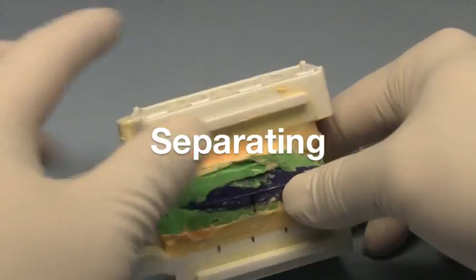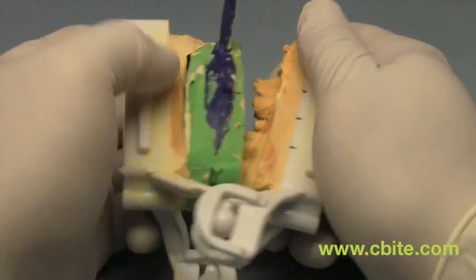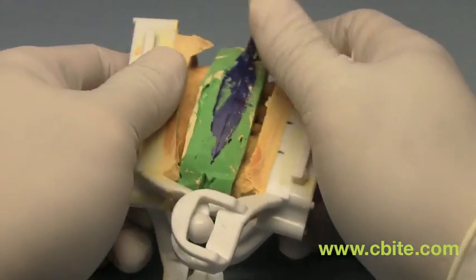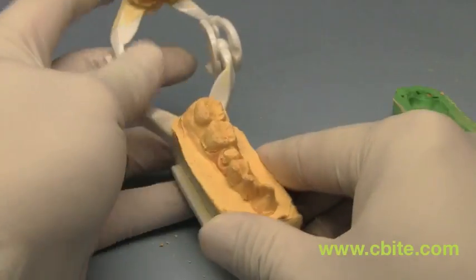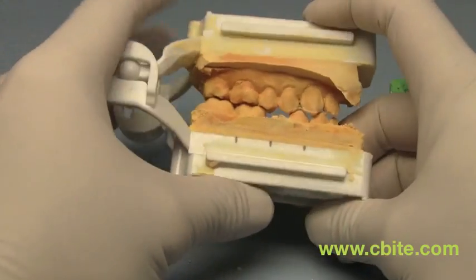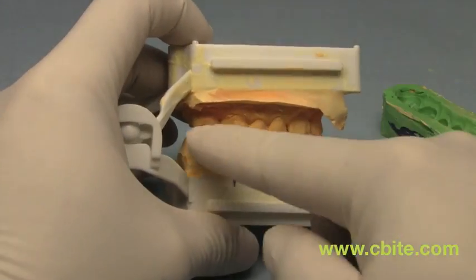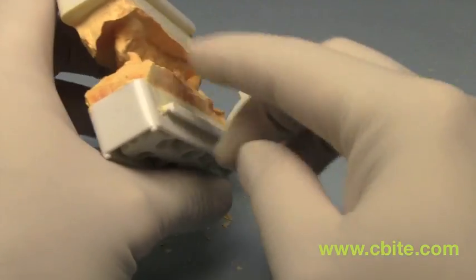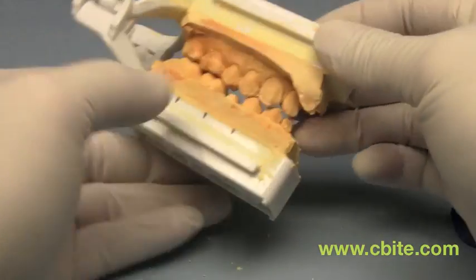Okay, now that it is set, we can take it apart. This area here needs to just be trimmed — trimmed a little bit, so it's just not that sharp.